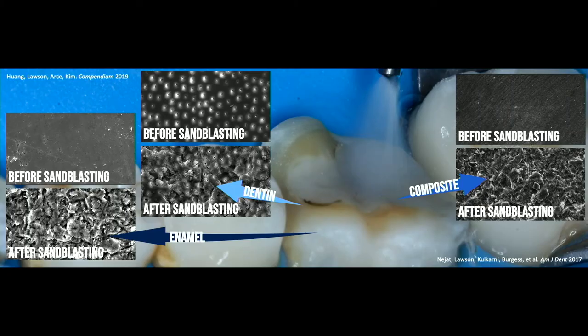Once I got the rubber dam on, I sandblasted the tooth preparation itself. We did a study looking at the effects of sandblasting clean enamel and clean dentin — it creates a little extra surface texture but didn't actually increase or decrease the bond. The real reason I sandblast is just to clean — to remove remnant permanent or temporary cement and get down to nice clean enamel and dentin. On the other side of that preparation there's a composite block-out. Bonding to polymerized composite is one of the most challenging things. We showed that sandblasting pre-polymerized composite significantly increases the bond, so sandblasting is both cleaning and improving the bond to the composite block-out.